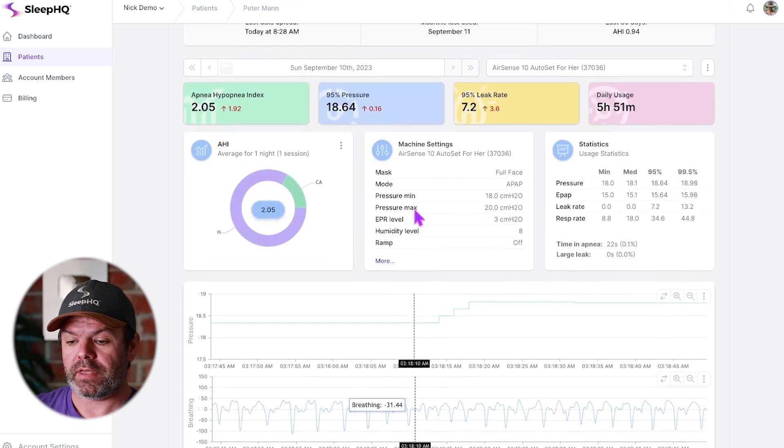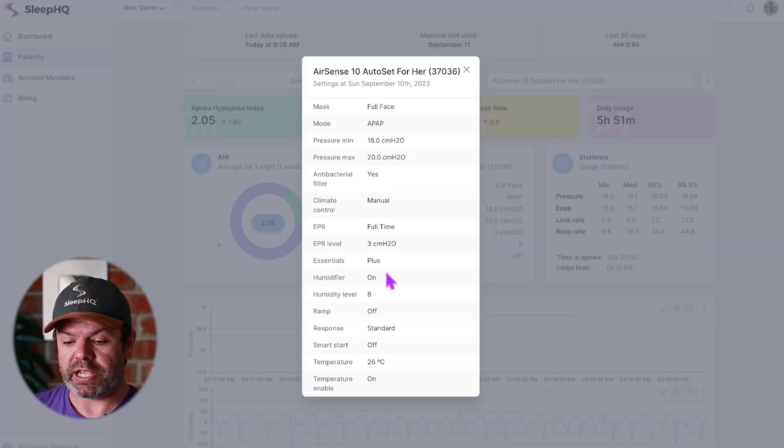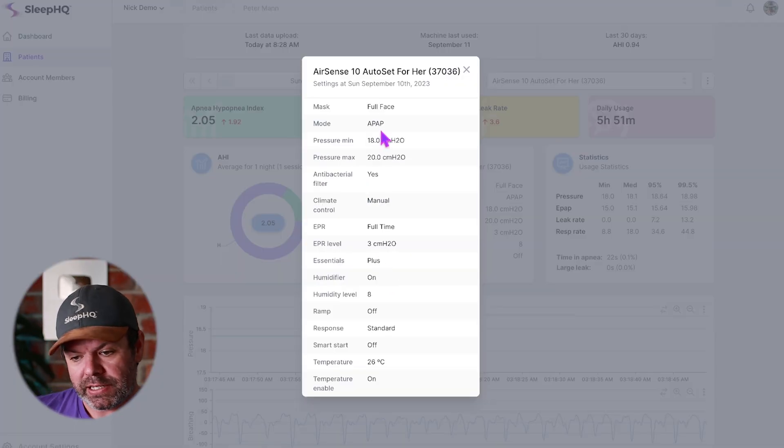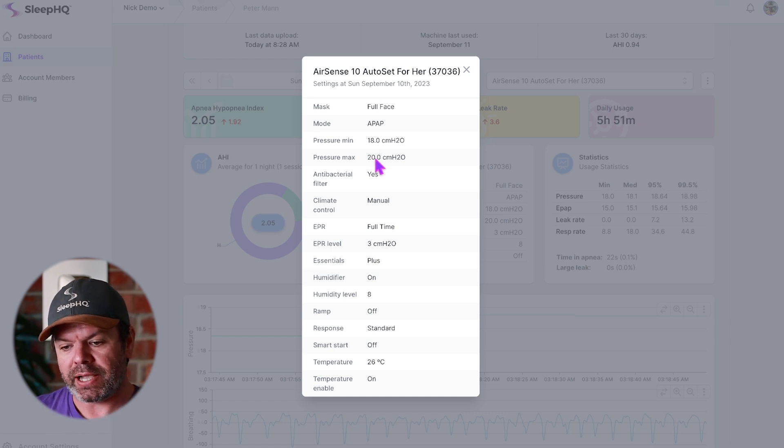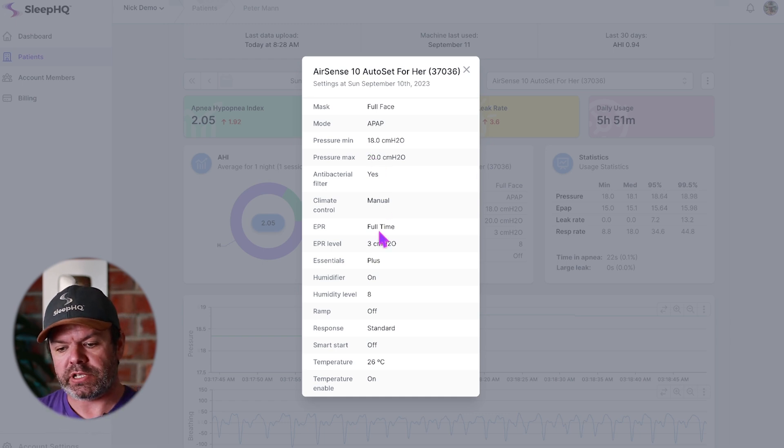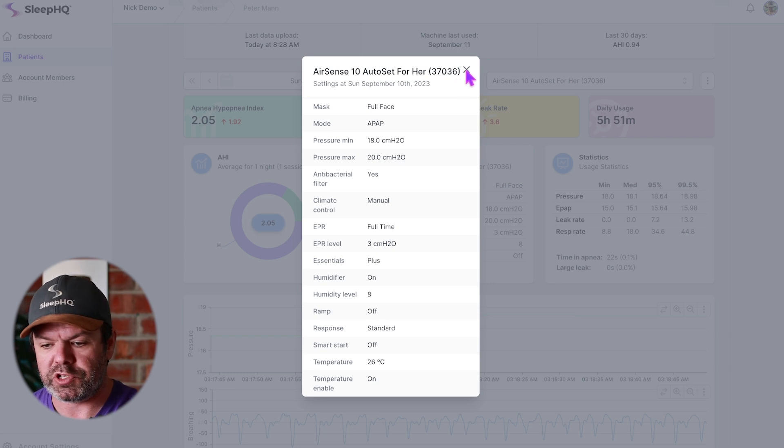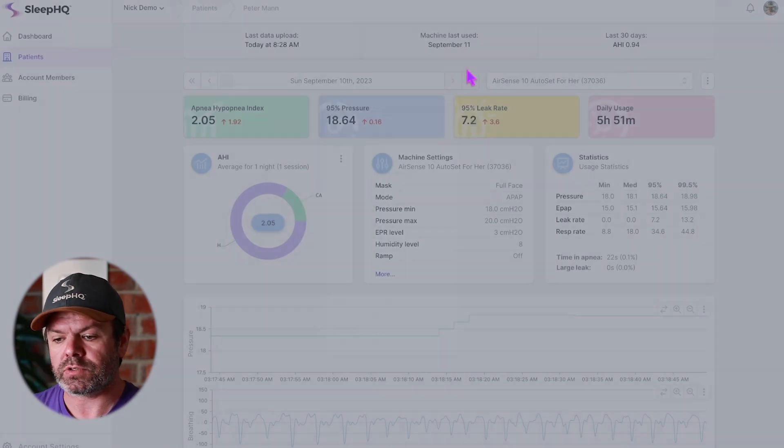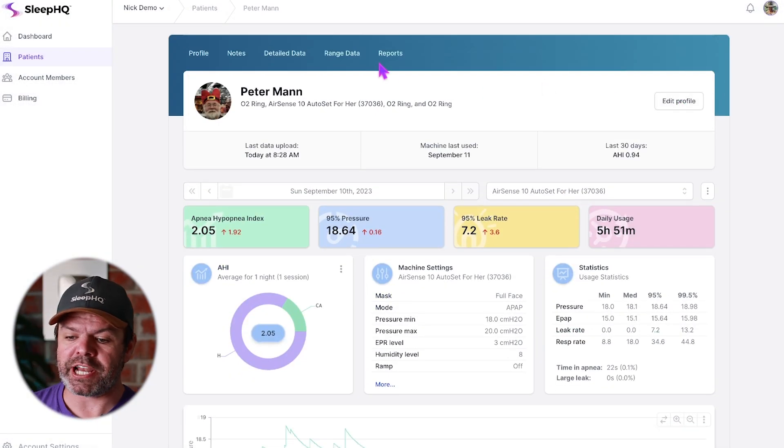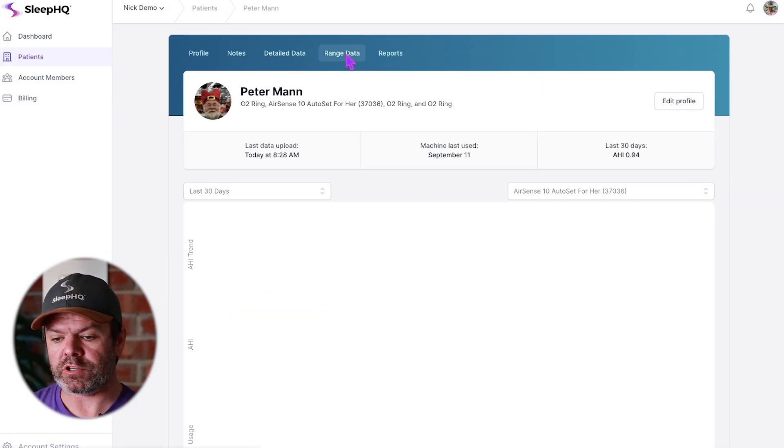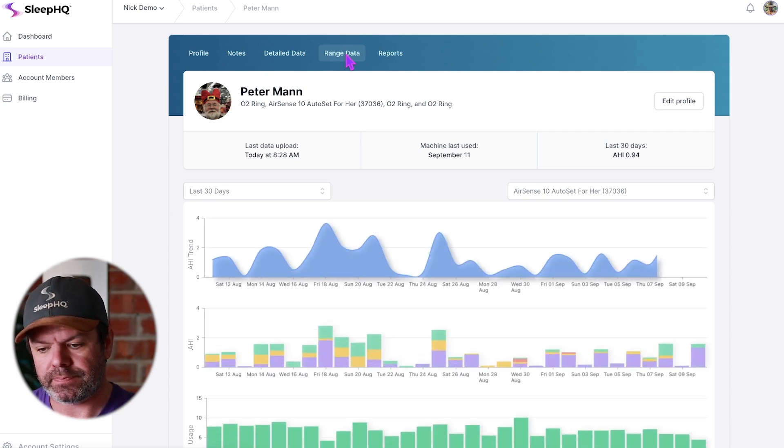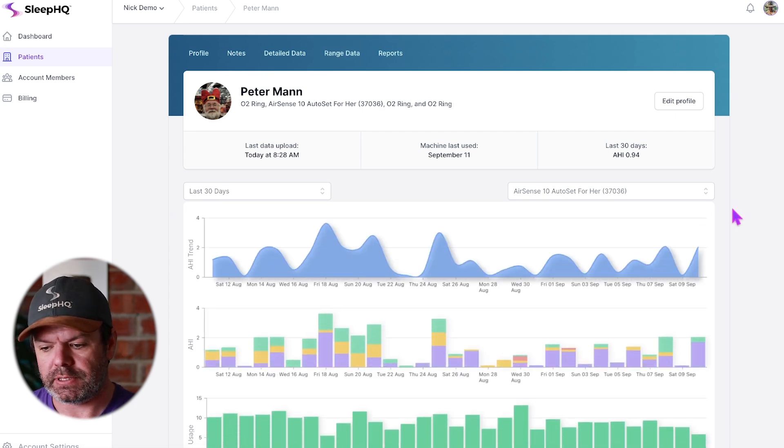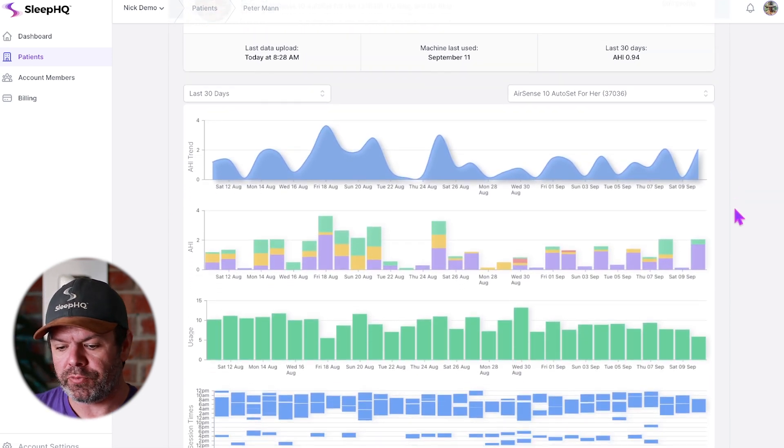I can also expand his machine settings, see exactly what he's got going on here. Pressure min 18, pressure max at 20. He's got his EPR on 3 and so on, his humidification levels. We also have the range data. We can have a look at the trends. Here's the trend over the last 30 days, looking pretty good.